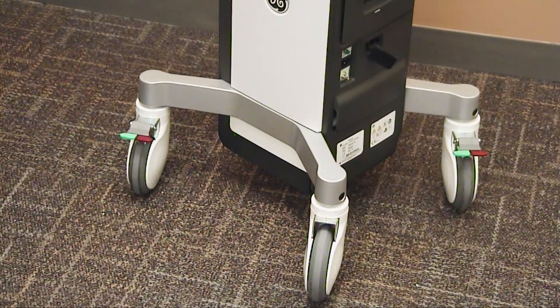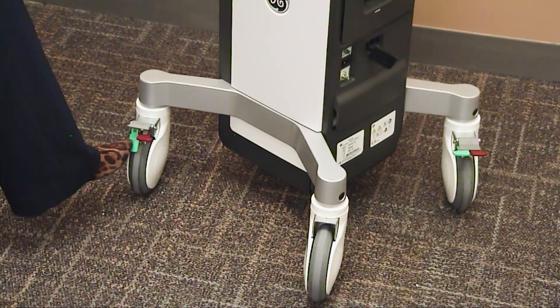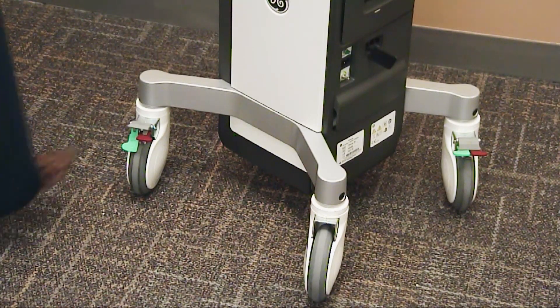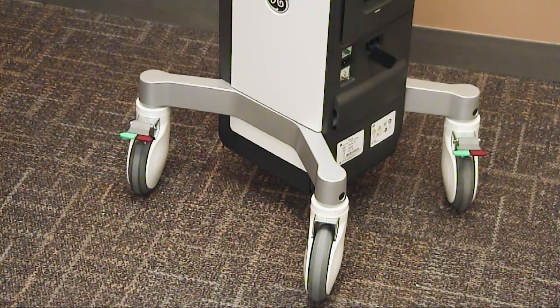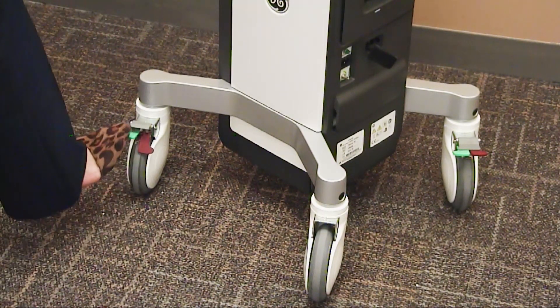The Venue wheels have both front and back steering and braking mechanisms. To activate steering, press down on your green lever. To deactivate, press down on your gray lever. To activate your brake mechanism, press down on your red lever, or both.